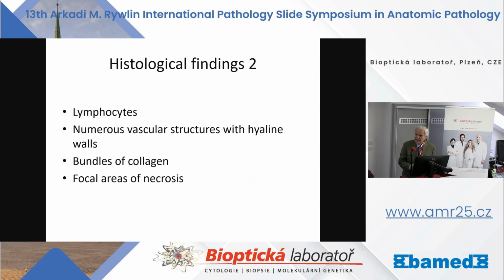Another thing that is possible to see, that I remember, is lymphocytes inside the tumor, and numerous vascular structures with hyaline walls and bands of collagen. Focal necrosis was seen, but in a very small part of this tumor.